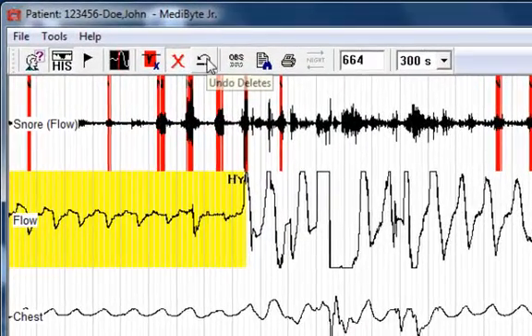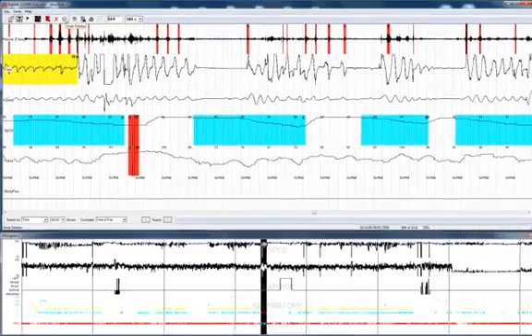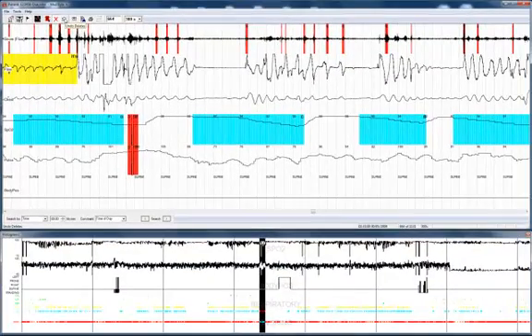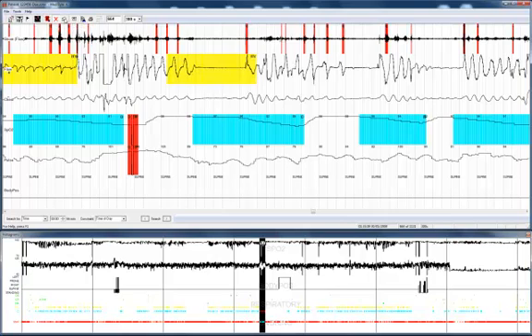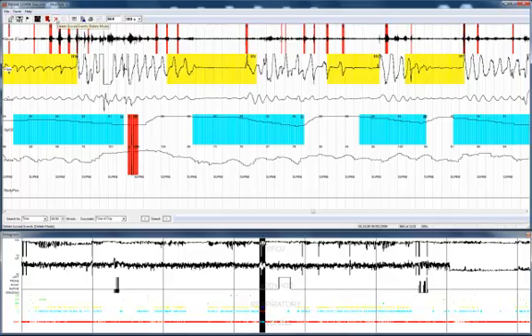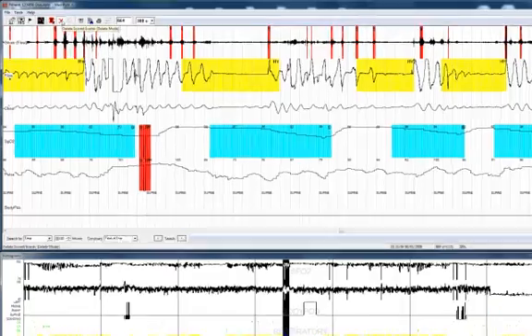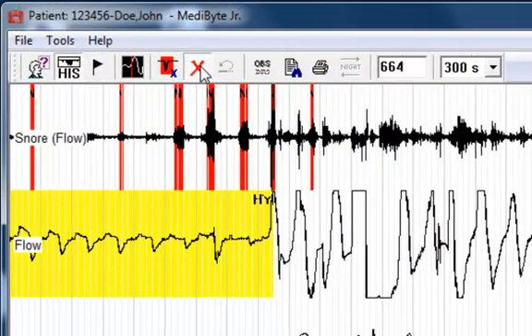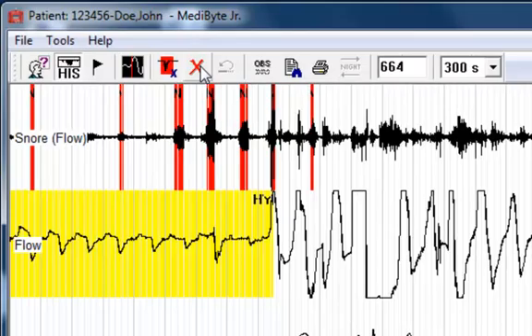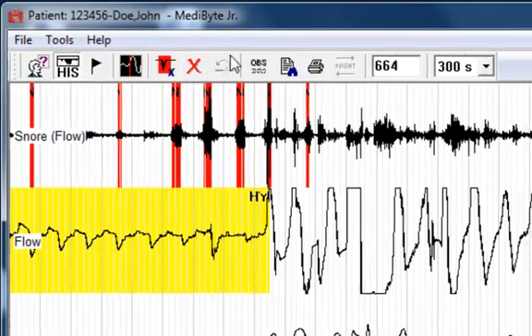This is the undo button. It replaces the events in the reverse order with which they were just deleted using the delete scored events button. And again, make sure you exit the delete scored events mode by clicking on the button, and you'll notice it no longer remains pressed in.